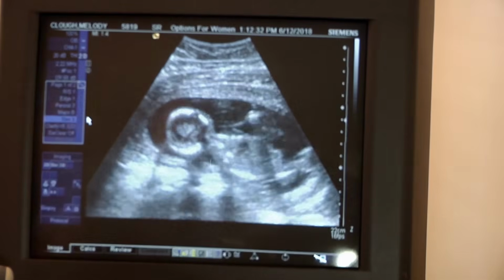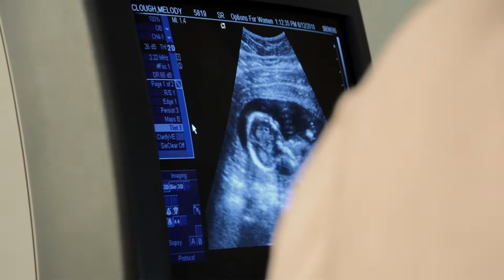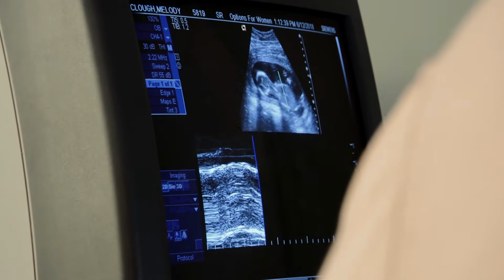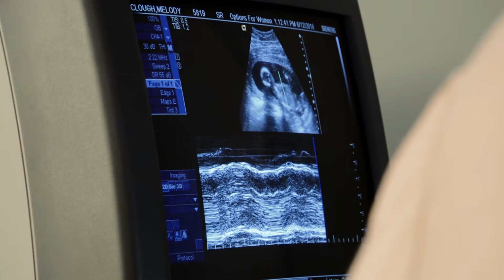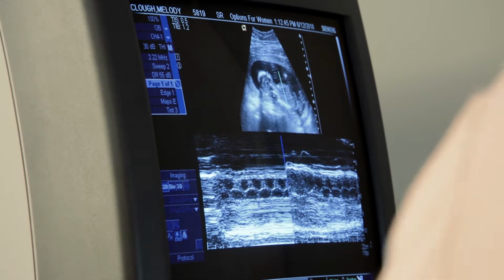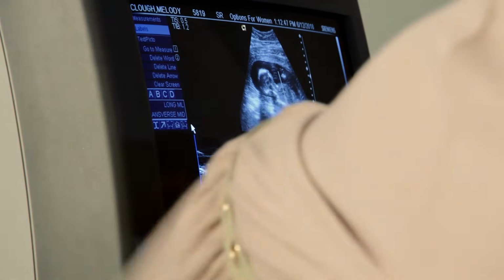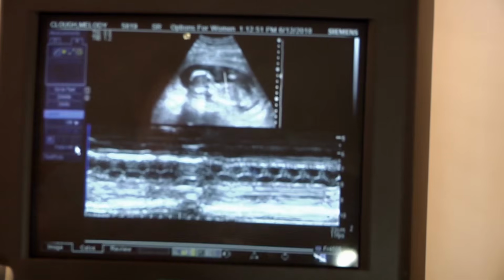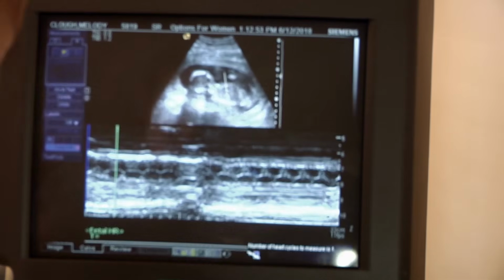Oh, you hit the wrong button. No, do it again. That's okay. Hit M mode. Now hit M mode again. He's gonna move for you. Forget it. You got a couple, though. Freeze. You got some. Yeah, you got a few. Sometimes that's all you get.